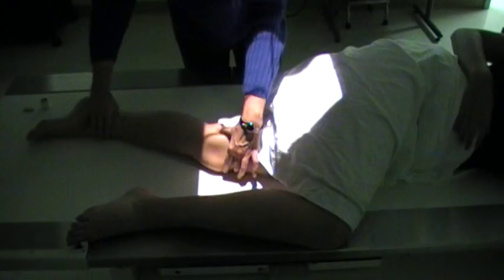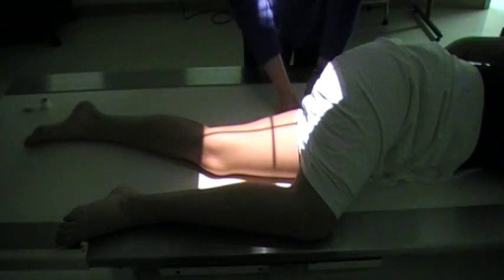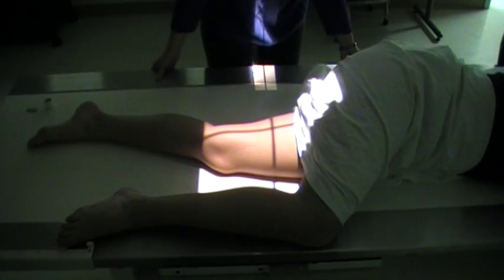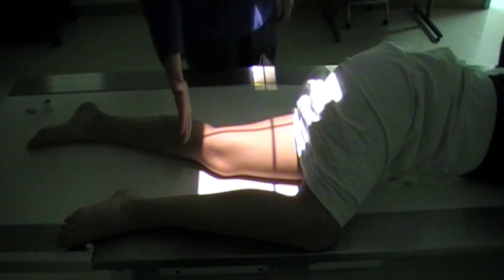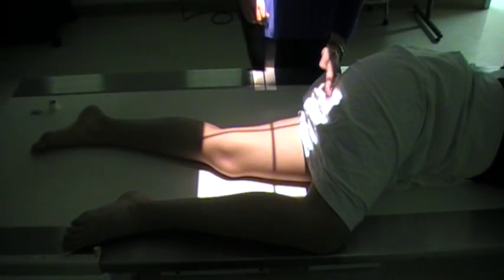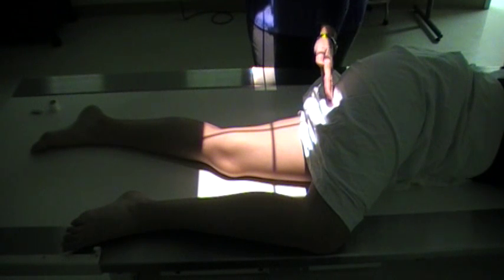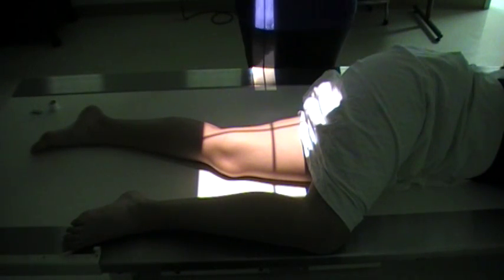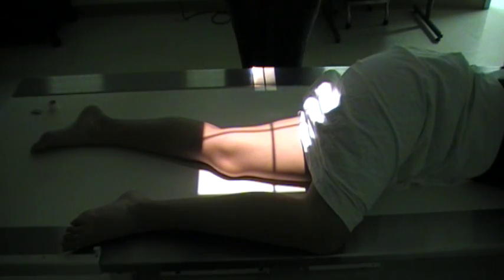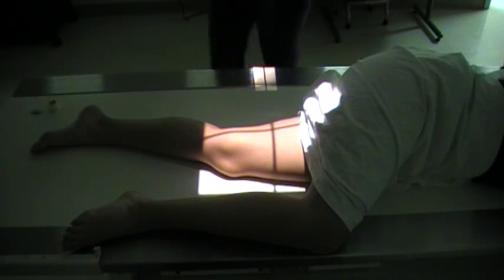Okay, now with this projection, I'm going to have the patient cross this top leg all the way over. I'm going to bring this femur back, okay, and then on this projection we're going to get the femur on beyond the knee. So the light field will look about 2 inches below the knee. Okay, the top of the light field will go all the way up till it hits this edge of the back of the thigh. Okay, so this will be our lateral knee, our lateral femur to include the knee. Okay, you can relax now.